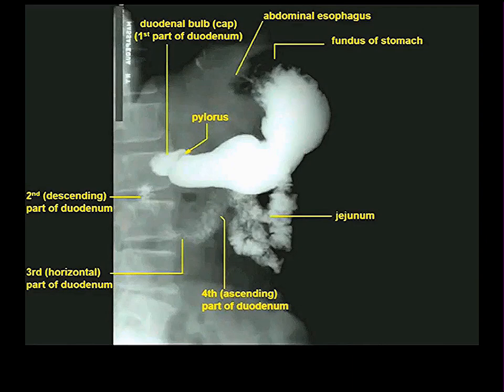I was going to say standing. Well, I'll tell you now, this person's lying down. So now you've just done where they're lying down, their stomach or their back? Stomach. Why do you say so? Stomach is the answer given. Why do you say so? Because the fundus is on the anterior side of the body.